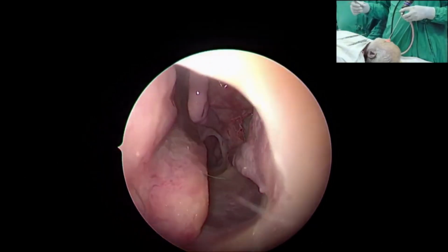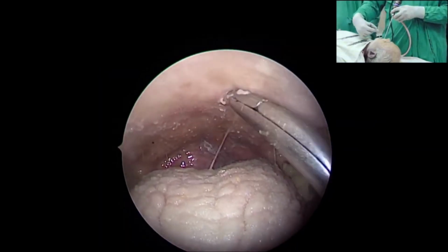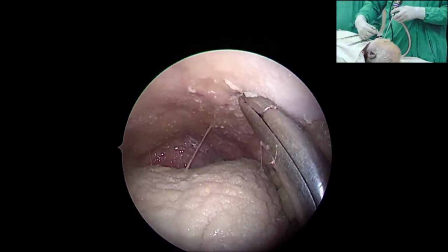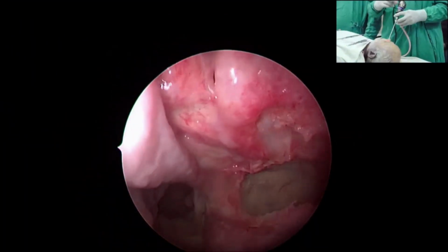You have to infiltrate through the oral cavity, one centimeter anterior to the palate, and go into the Greater Palatine Canal and inject, so that it gives a spasm in the vessel overall, that is the sphenopalatine artery. So that has an impact.